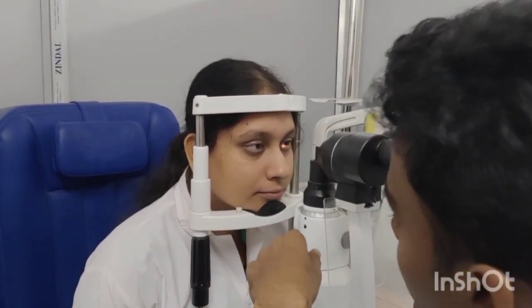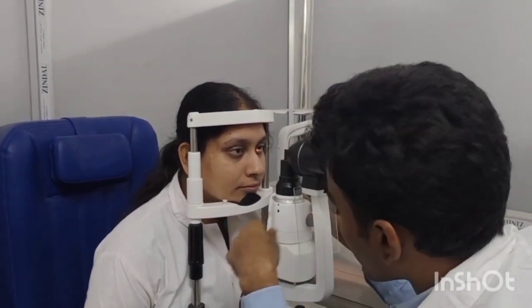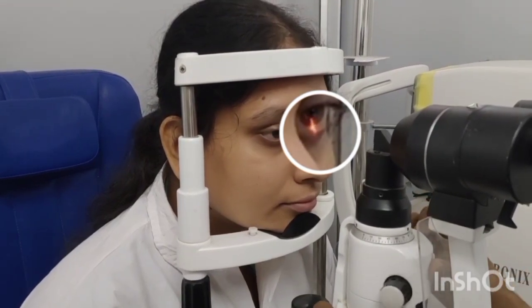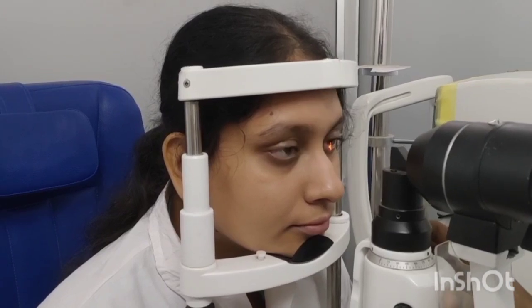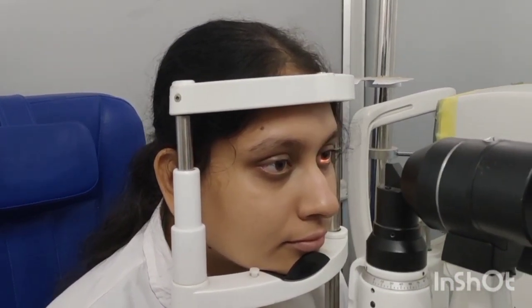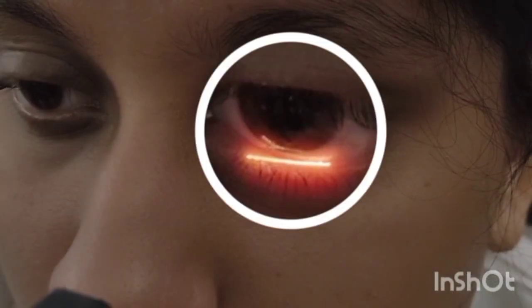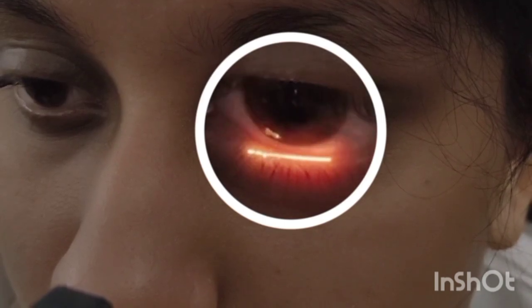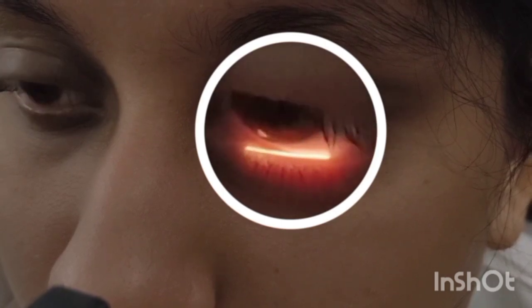Now what we need to do, just look at this slit beam. It is now a horizontal beam. Okay, so in the slit lamp, if the beam is not horizontal, suppose the beam is vertical like this, then for measuring the tear prism height, we first need to rotate this beam to the horizontal one. Okay, and then this horizontal beam should be aligned with the lower eyelid margin. So you all can see that this slit beam is now aligned with this lower eyelid margin.